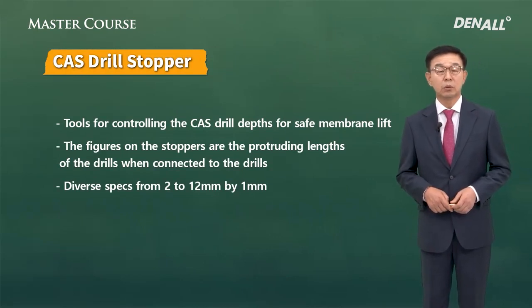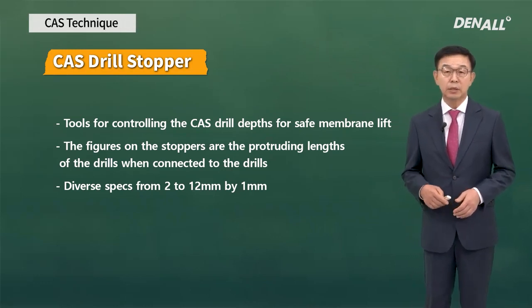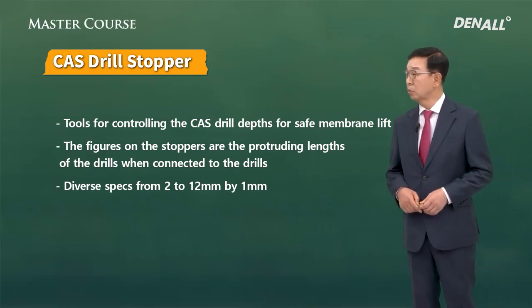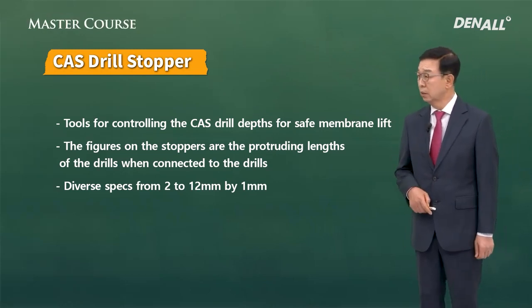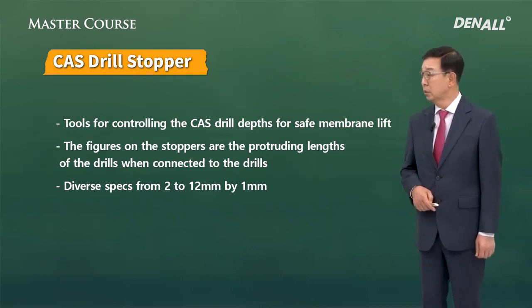In the CAS drill, there's a stopper which ranges from 2 to 12 millimeters. You can gradually drill the sinus floor for the sinus lift. If you use it well, you can do a sinus lift in the safest way without damaging the sinus membrane, and you can place the implant in this way. It's very useful.